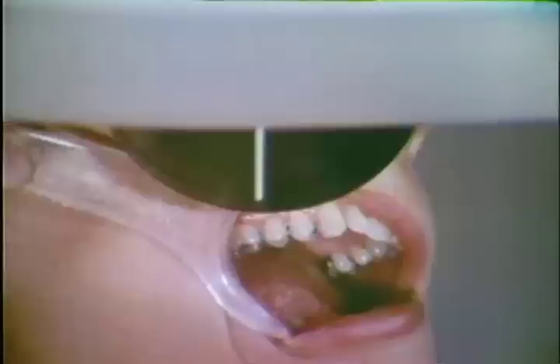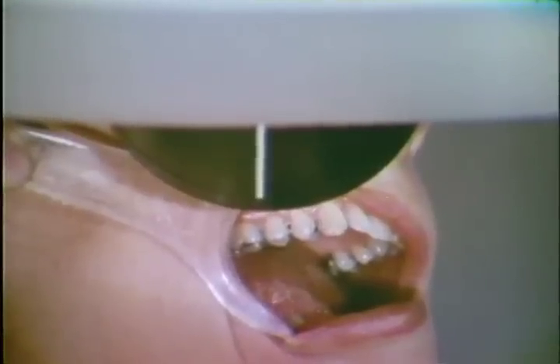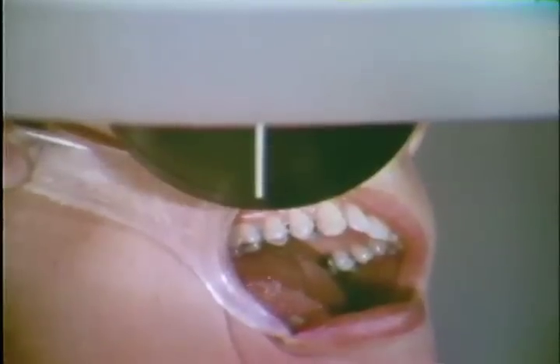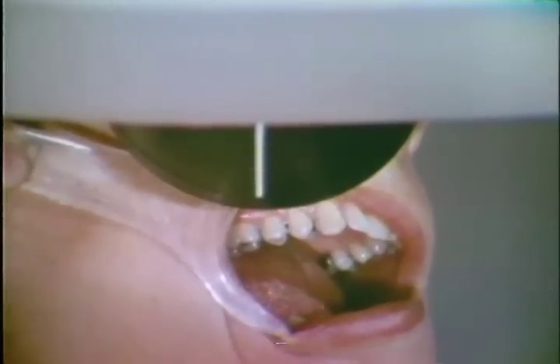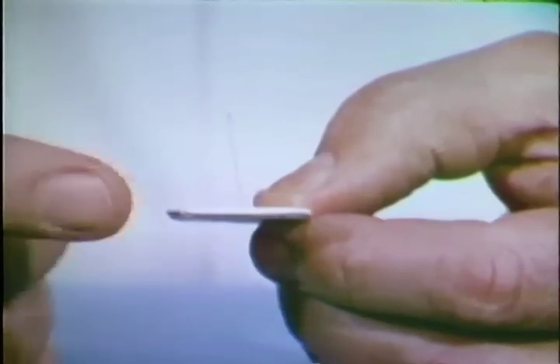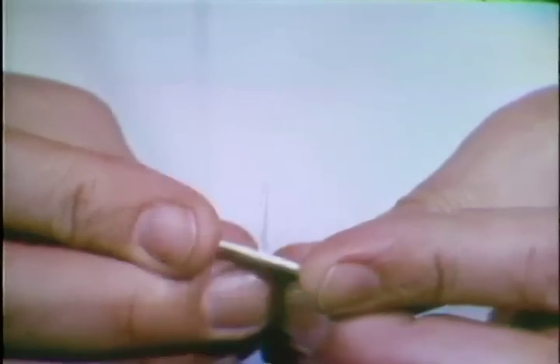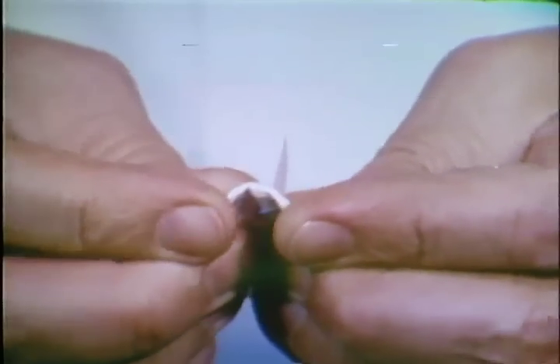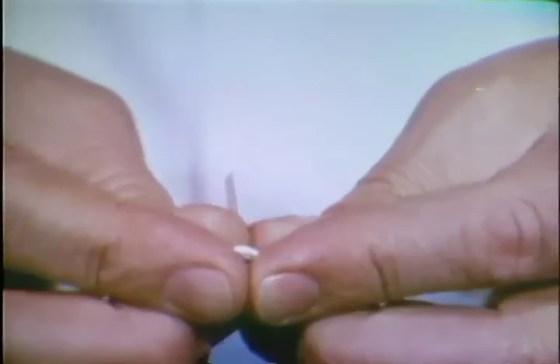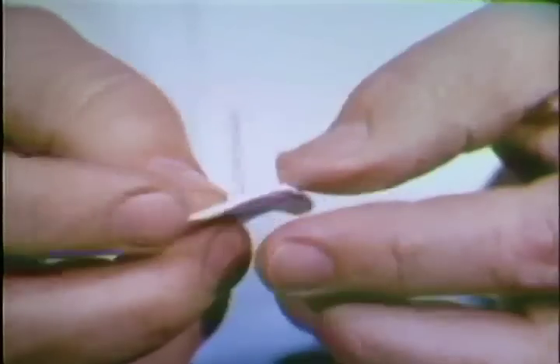The central X-ray beam should be directed through the interproximal space between the upper second bicuspid and molar, and aligned parallel to the cusp tip line of the bicuspid. We are now ready to insert the film. The number three packet is generally acceptable. Since the packet is flat, the corners may be uncomfortable to the patient and should be rolled back. This must be done carefully to avoid creasing the film.